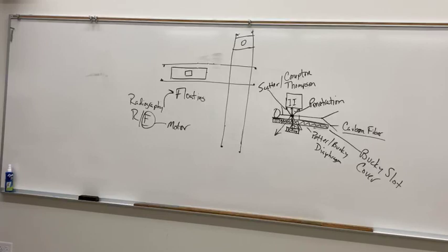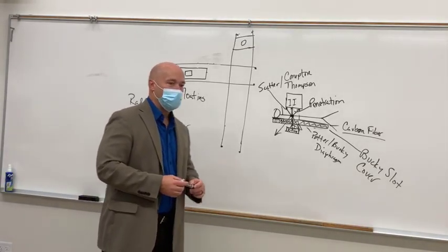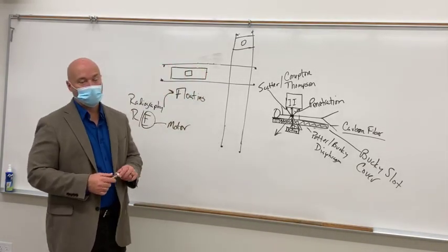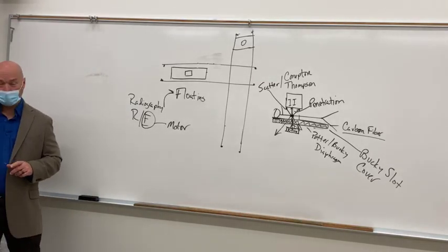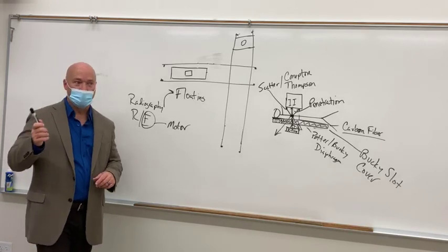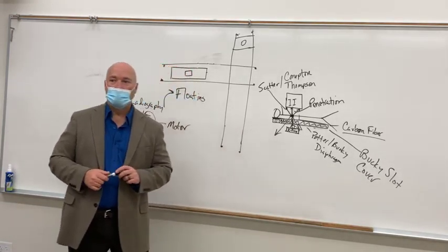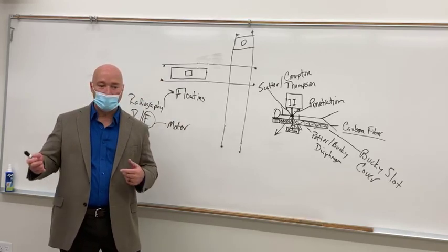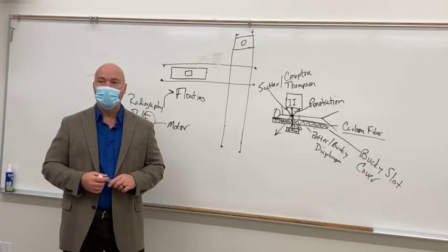So what else in fluoroscopy can you use to reduce your dose? Distance. Distance is a big one. Distance is good for you, but as far as the user of the unit goes, be it a PA, a doctor, a tech, gloves, so you've got shielding.